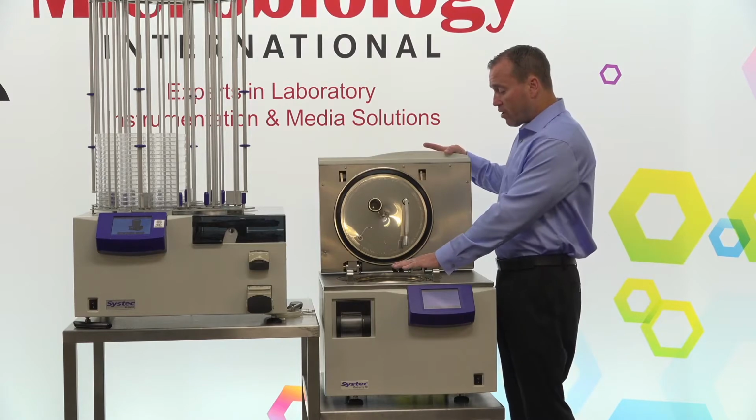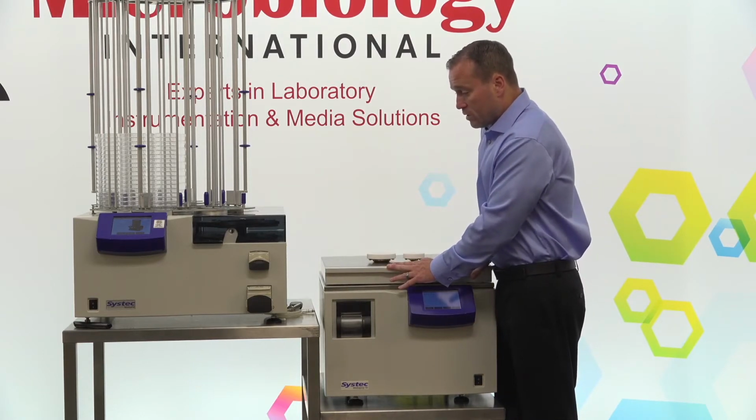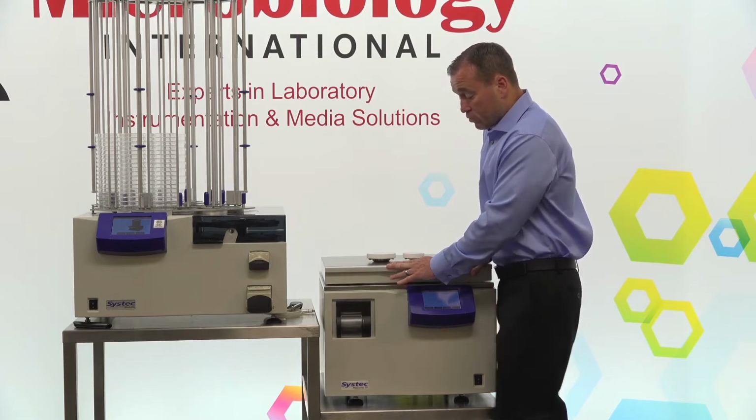So once we've added our components, we would close the lid down. It will seal.